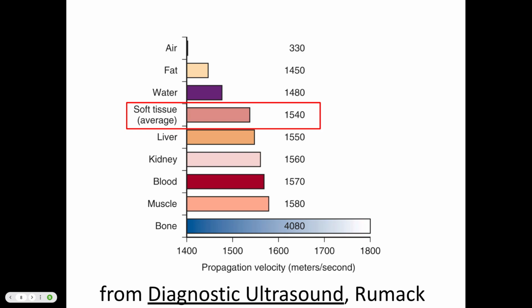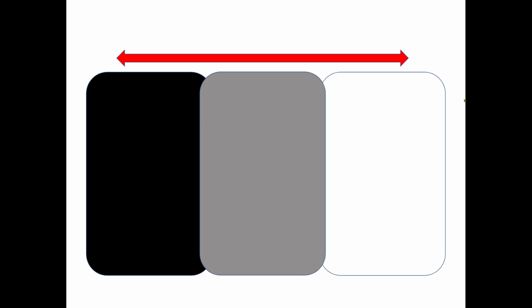The number of signals that come back from that depth, or their return at that time, that's what informs how bright it is. So that is echo ranging. Now you're a physics master.